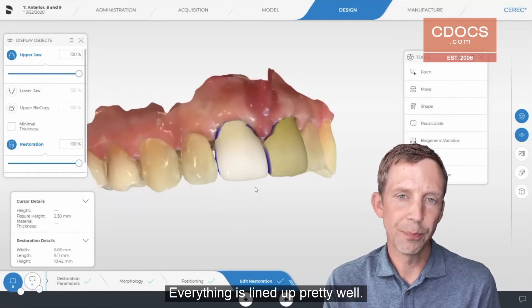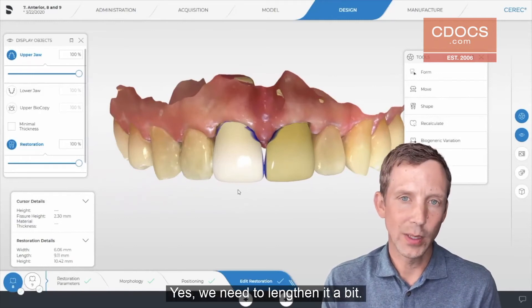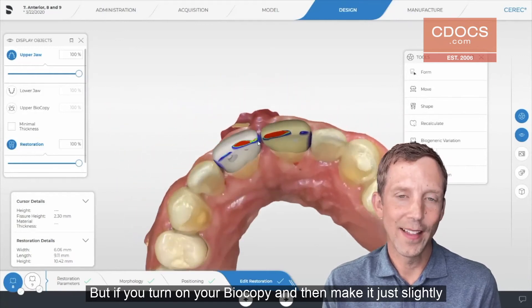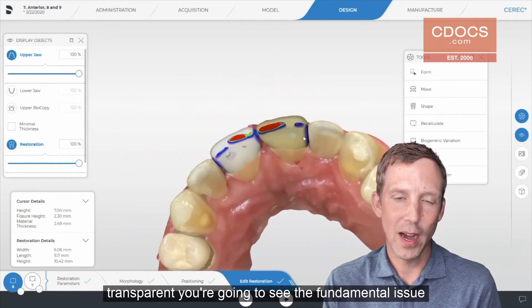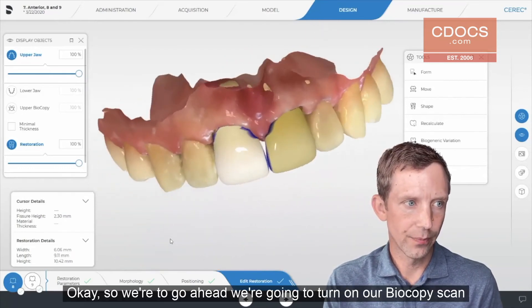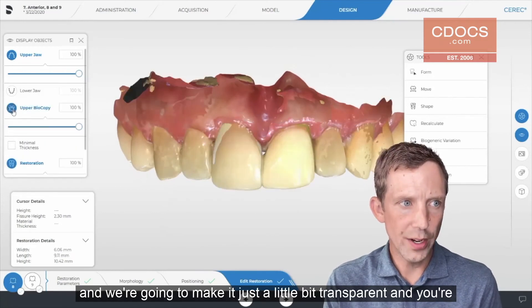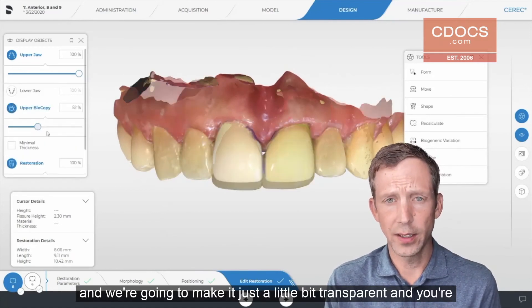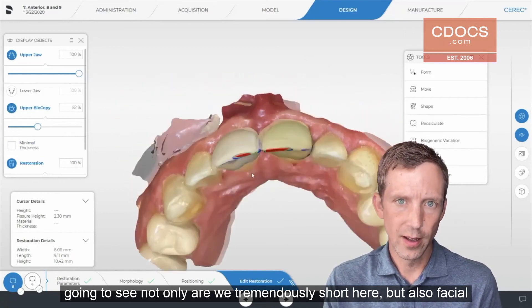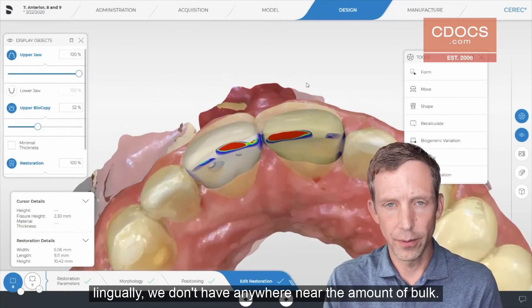So if you look at this proposal, everything is lined up pretty well, it doesn't look that bad. We need to lengthen it a bit, but if you turn on your biocopy and make it just slightly transparent, you're going to see the fundamental issue of not having guidance. We're going to turn on our biocopy scan and make it just a little bit transparent, and you're going to see not only are we tremendously short here, but also facial-lingually, we don't have anywhere near the amount of bulk.